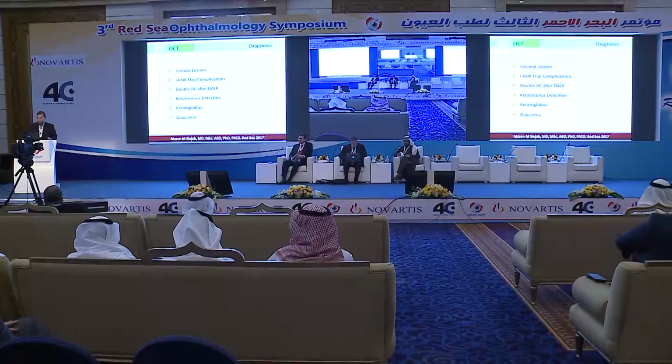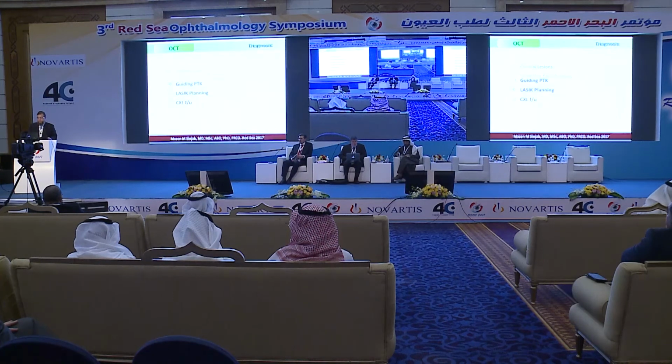I use it to diagnose some corneal lesions, LASIK flap complications, double anterior chamber after lamellar keratoplasty, in keratoconus detection, keratoglobus diagnosis, and in glaucoma diagnosis. In addition, it can be used to guide the PTK and for LASIK planning in some cases, and to do follow-up after corneal cross-linking.